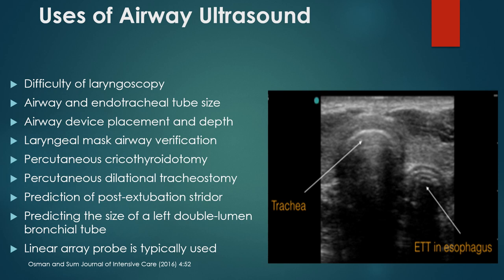I'm not real sure it has a high utility in adults, but I would think that it's got a very high utility in a pediatric population, especially just sticking a probe on a trachea and getting a good size of the outer diameter of the endotracheal tube. Airway device placement and depth.